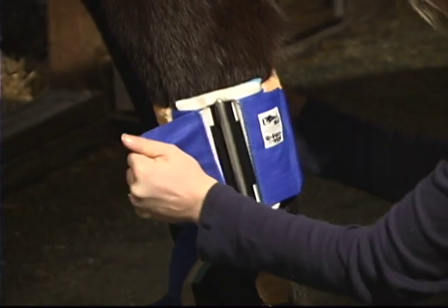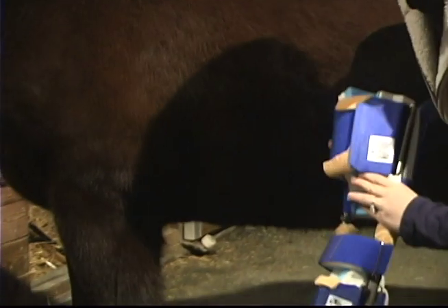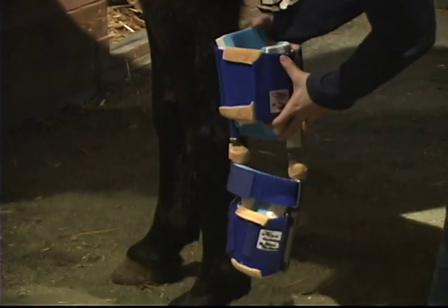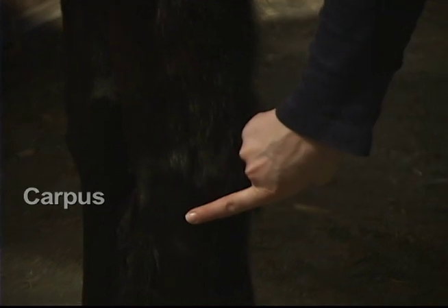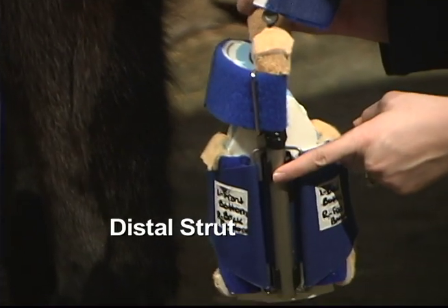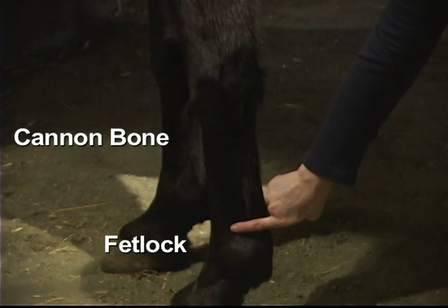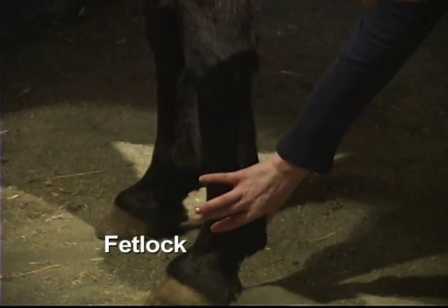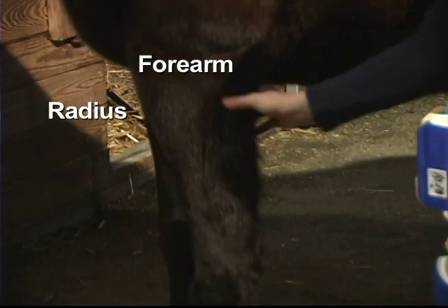For this demonstration, I'll be fitting the splint to the left leg and will be following the left labels only. Hold the Dynasplint system up to the animal's leg to check the length of the proximal and distal struts. The large cam wrapped with the terrycloth padding should line up with the middle of the carpus. The distal struts should extend as far down the cannon bone without coming in direct contact with the fetlock, and the proximal struts will extend as far up the radius, falling right below the large muscle on the forearm.